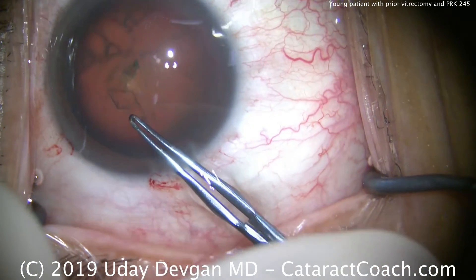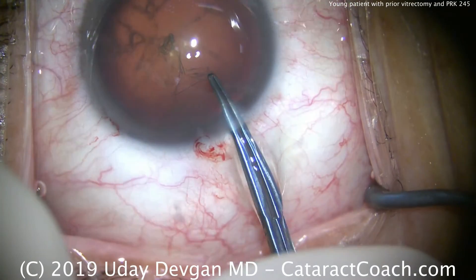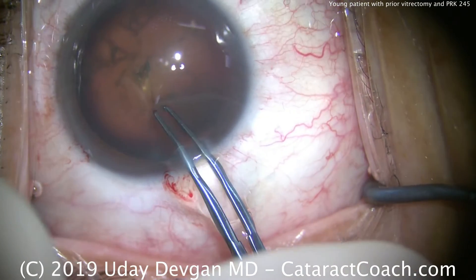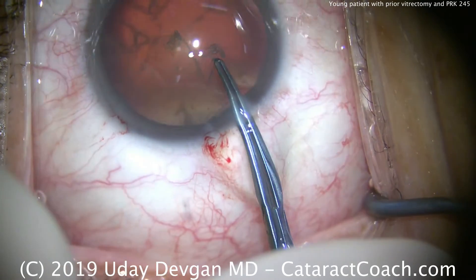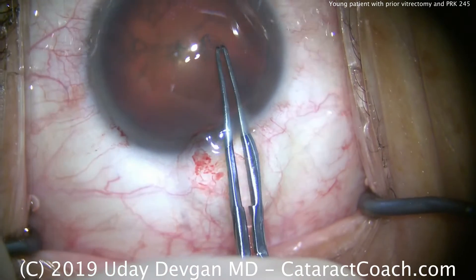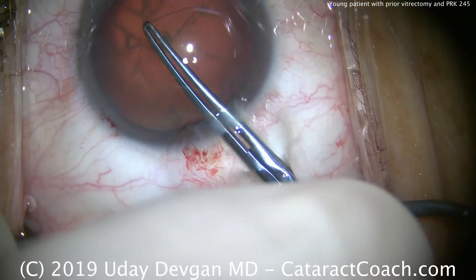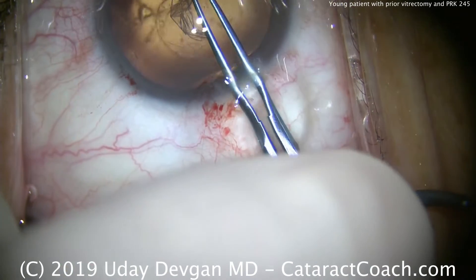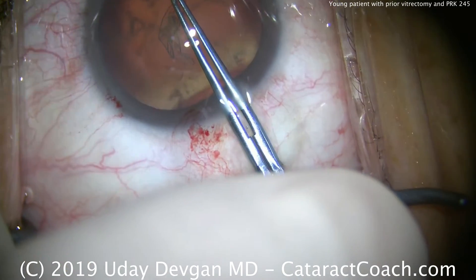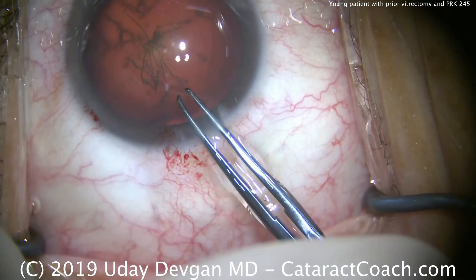We're adjusting the lights to get a good view and we're going to do our capsulorhexis, taking our time. I'm going slowly — it's very important that I achieve a good controlled capsulorhexis. In a young patient, the capsule is more elastic. The patient is doing a good job of looking at the light, but we do little steps at a time to ensure an appropriately sized capsulorhexis.